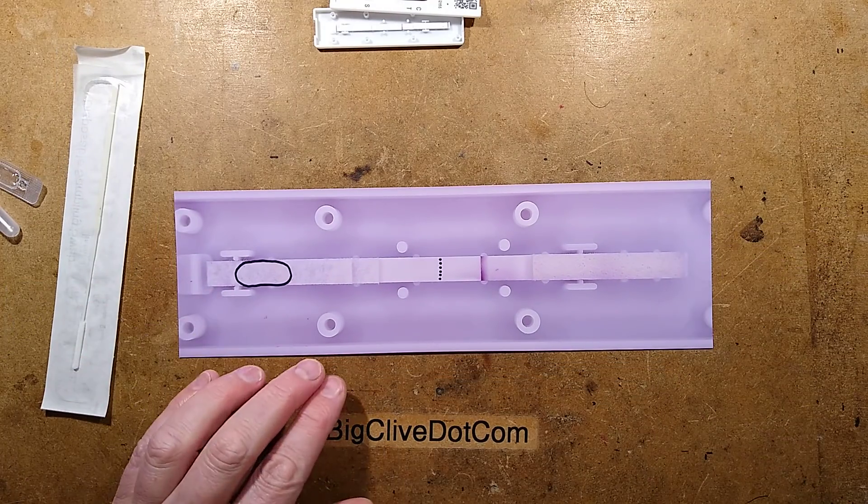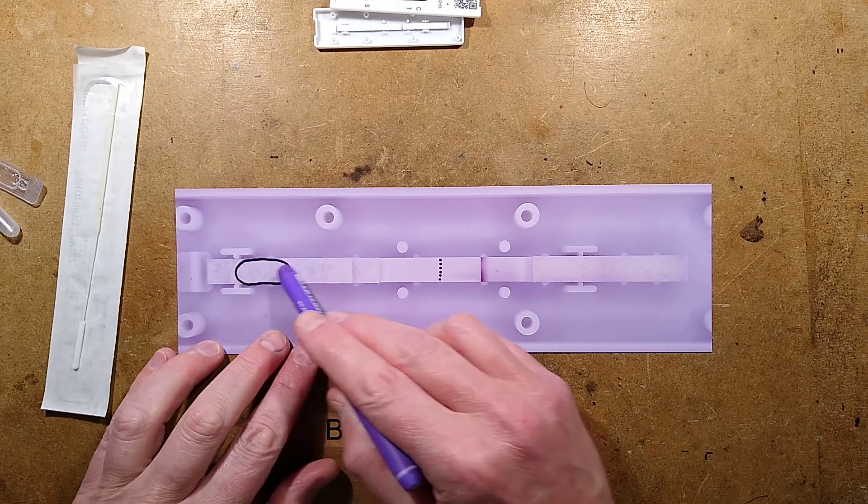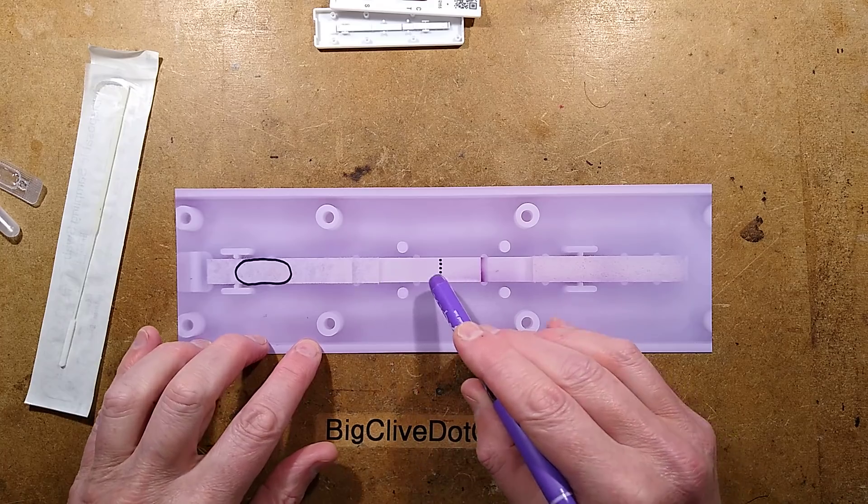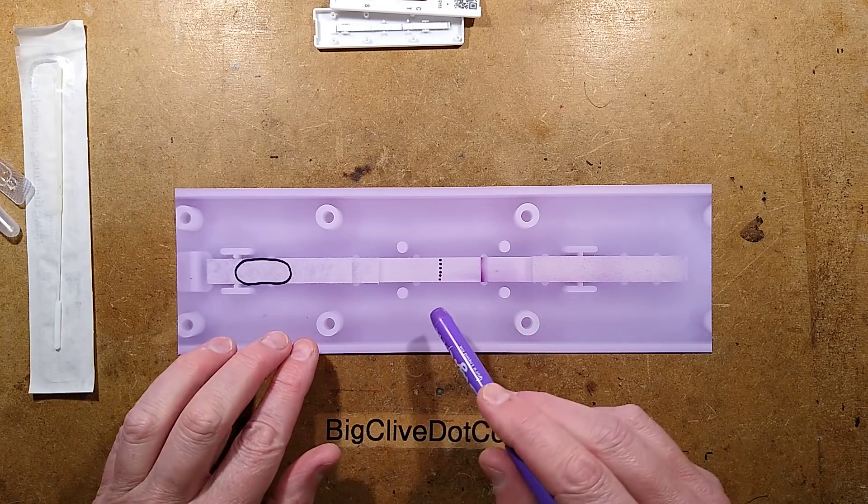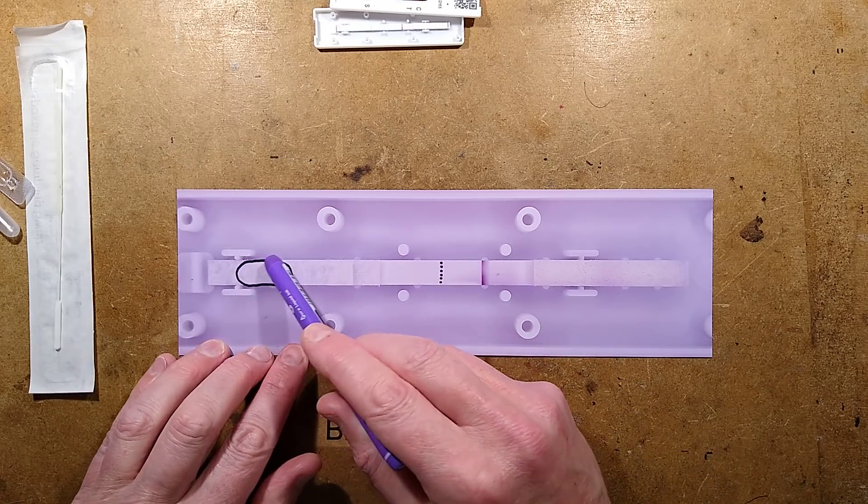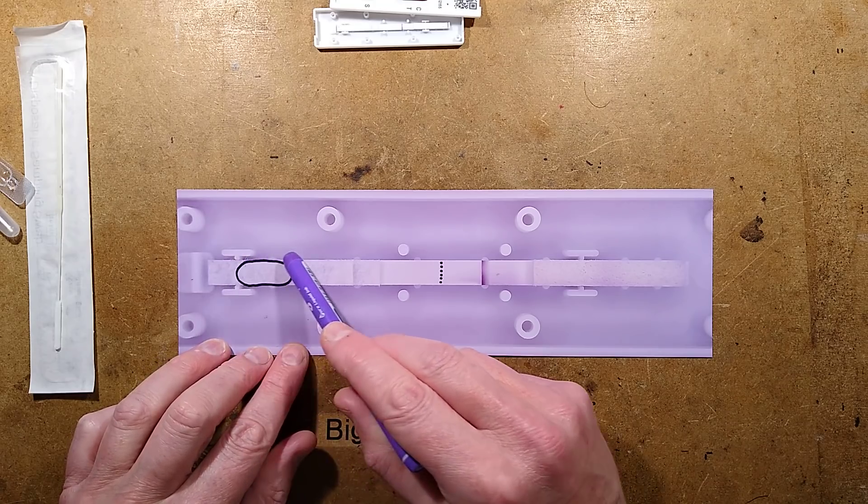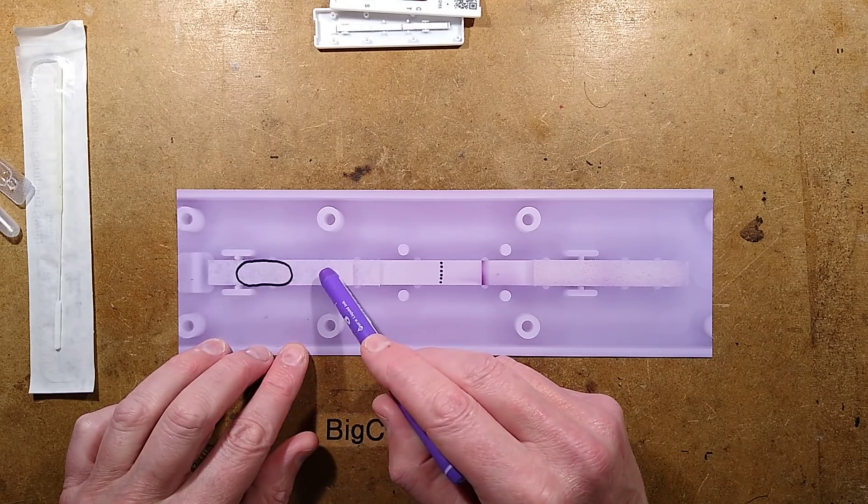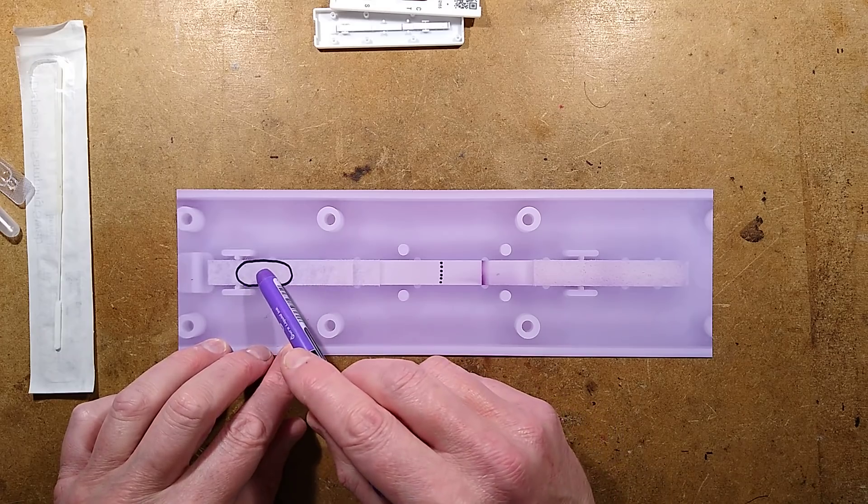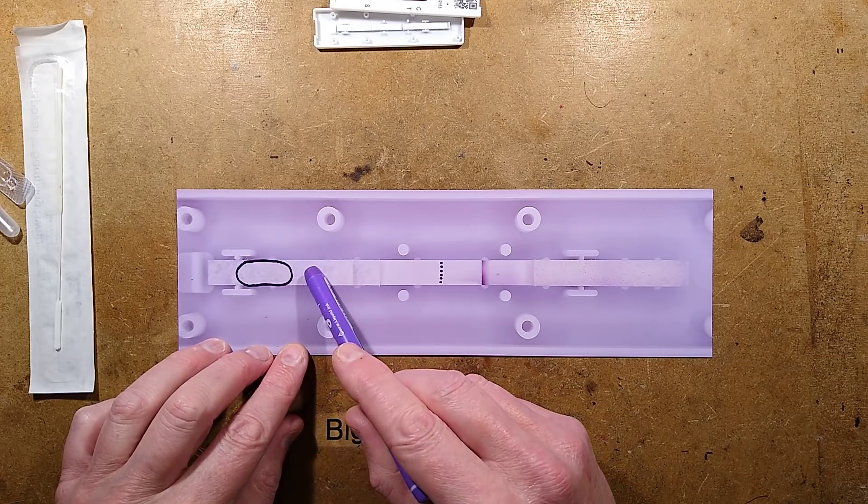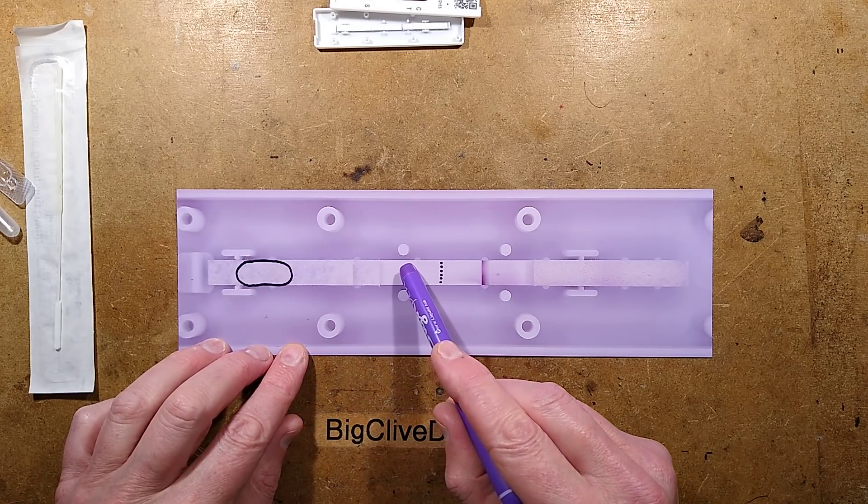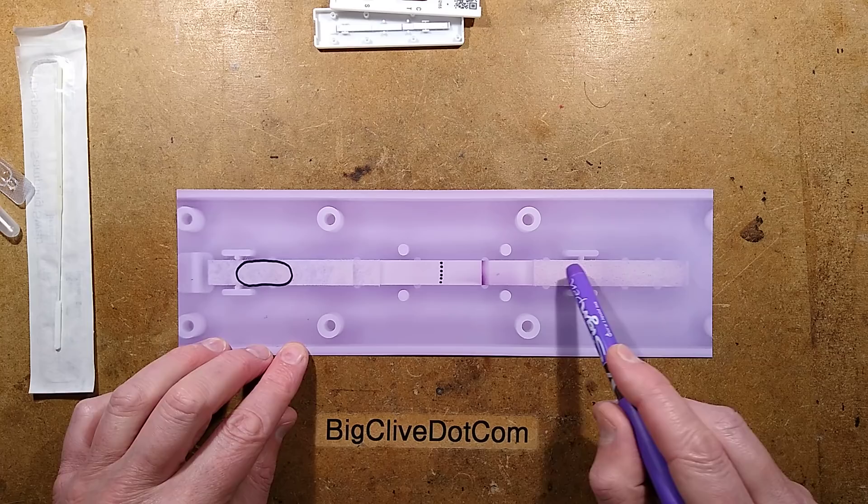So inside is this wicking pad and it's formed of multiple materials, multiple layers with chemical impregnations in parts of it. When you put the carrier liquid in with the potential virus, it lands in this area and absorbs into this large area wicking pad, which is quite thick. And then it starts wicking along like blotting paper up to the other end.